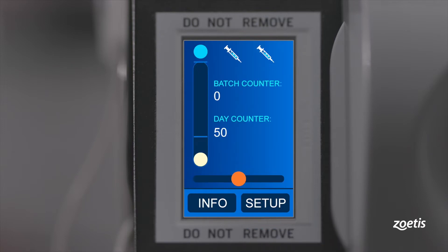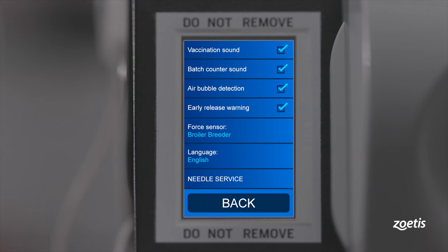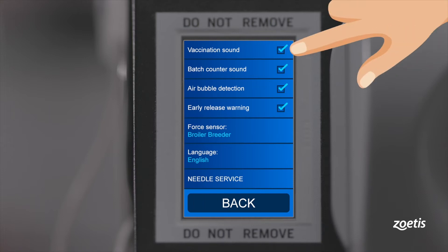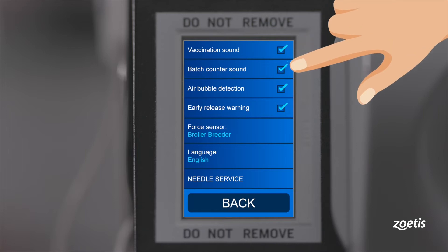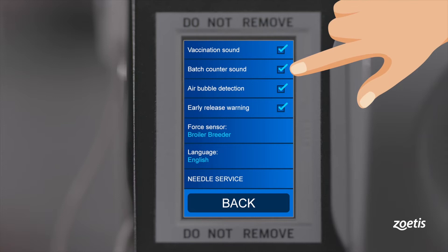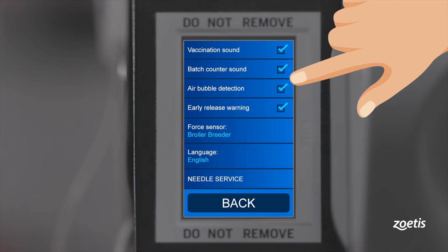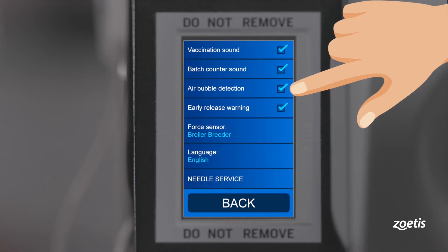Press the setup button to adjust several alarm and safety functions. After each injection, a vaccination sound indicates the proper vaccine administration. Batch counter sound: each time the batch counter reaches zero, the device provides a signal accordingly.